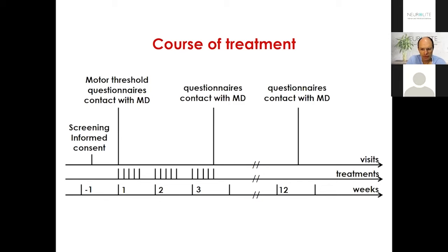I think the best way to introduce how to use TMS in clinical practice is to follow the course of treatment, and we will go through it and focus on the different moments: when we see the patients first, when we start the treatment, and in every treatment session, what we are doing and who does what.